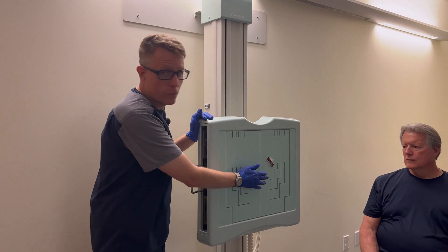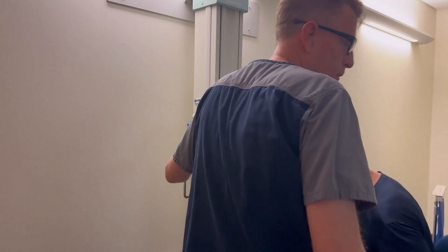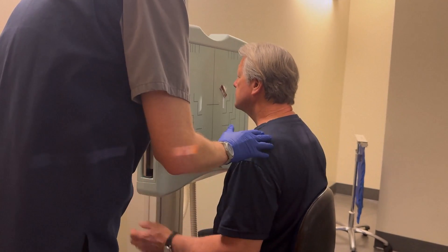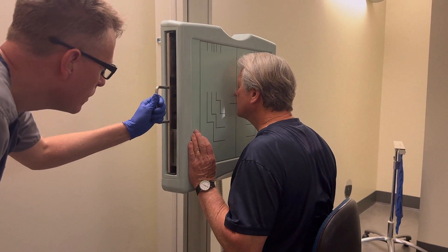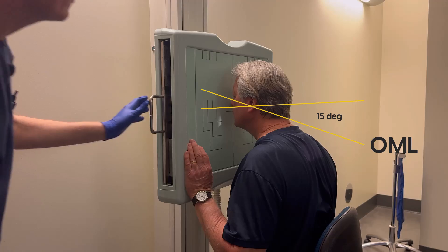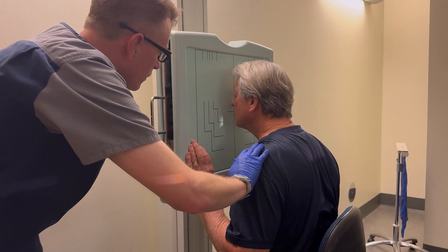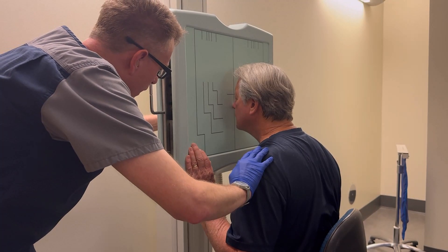I'm going to have you bring yourself over and get you close. You're going to face the board directly, then just put your nose against it. Bring your chin down slightly. I'm looking for about 15 degrees from the orbital line to the center of the Bucky — 15 degrees extended up from there. Once I have that correct, I'm going to move my Bucky so the centering is up at the nasion and glabella area.